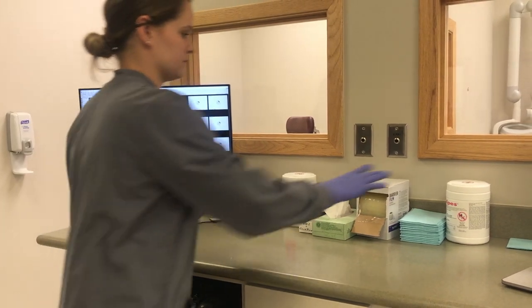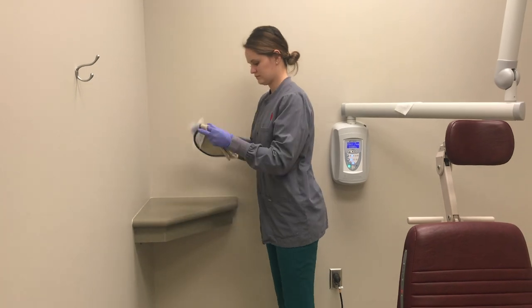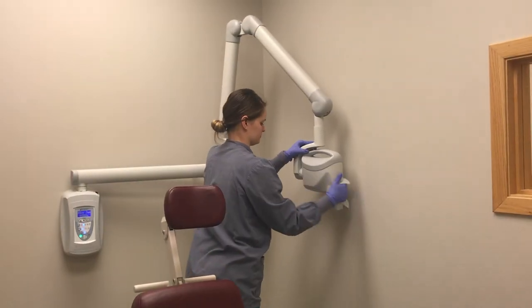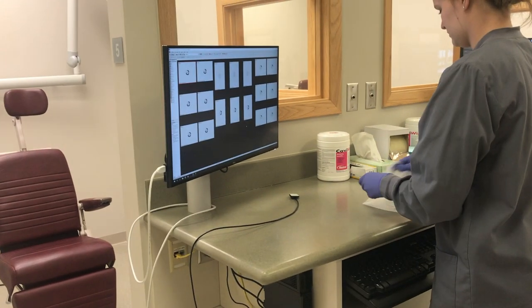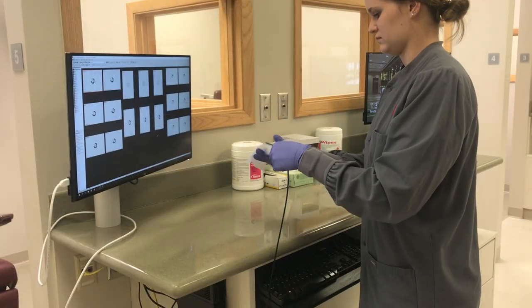Get out 4 Cavi wipes. 1 for the thyroid collar and small counter. 1 for the X-ray tube head. 1 for the counter. And 1 for the sensor.